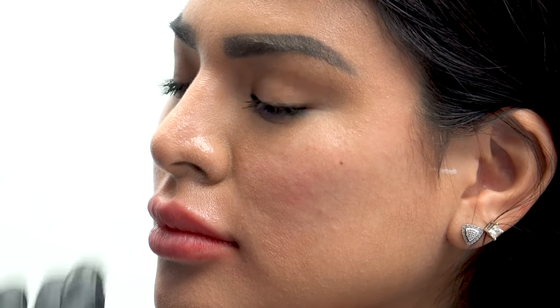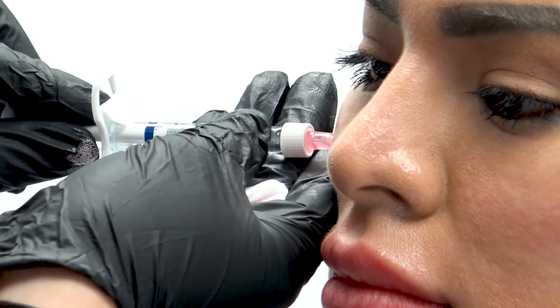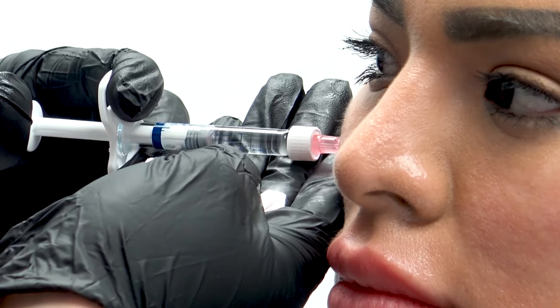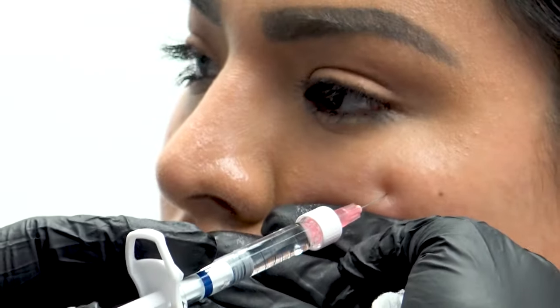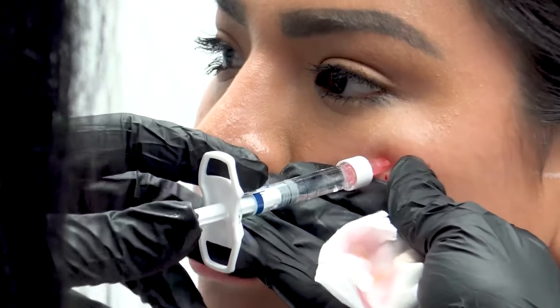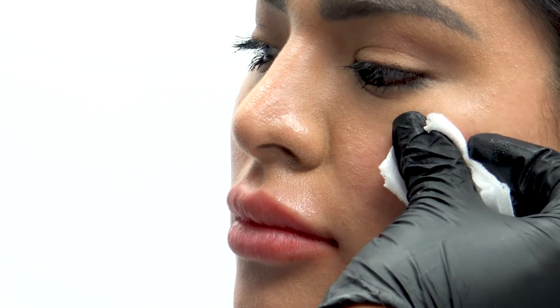Now I'm going to go on this side — tiny little pinch. She has been icing before; I like to ice before the procedure because that helps to vasoconstrict any vessels. We're going down to the bone, we're aspirating, and we're injecting very slowly. She is a great patient because a tiny bit of filler goes a long way with this young lady. Down to the bone.